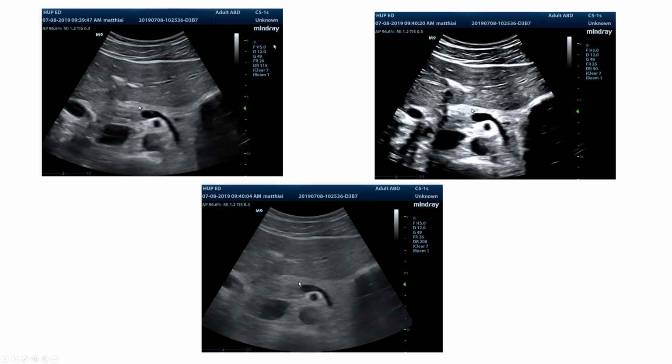And in fact, when we turn the dynamic range down from 115 all the way down to 50, that's exactly what we see. We see that the vessels like the splenic vein and the IVC are just completely anechoic and black, whereas they did still have some echoes over here, and that has something to do with, I guess, I'd left the gain a little too high. But anyway, really crank that dynamic range down, they're just black.